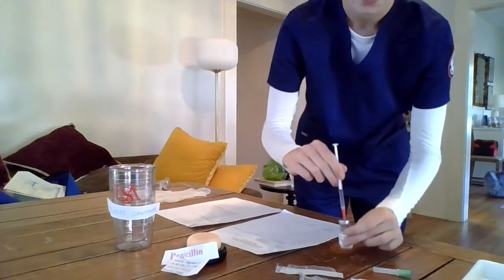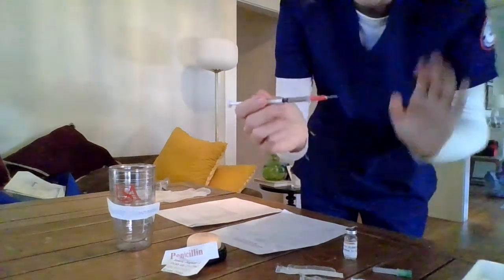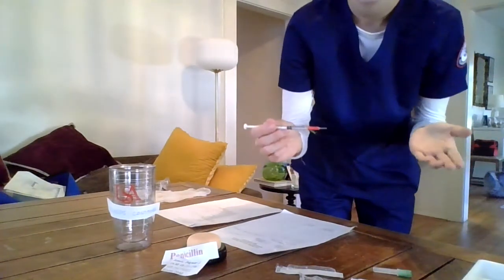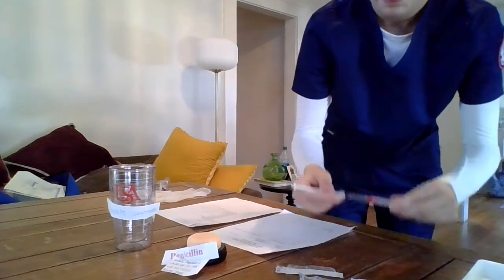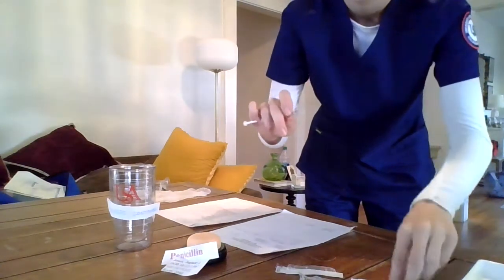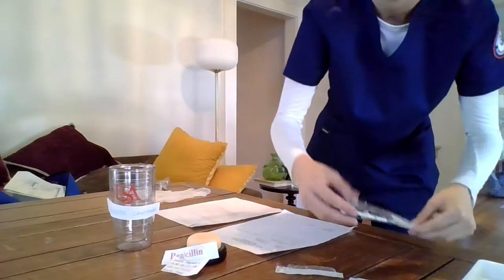So there's no bubbles. That is amazing. Now I'm going to recap my needle using a scooping mechanism. So I will scoop. And then detach this tip. We'll then reattach it to the appropriate needle, and we'll leave that there.